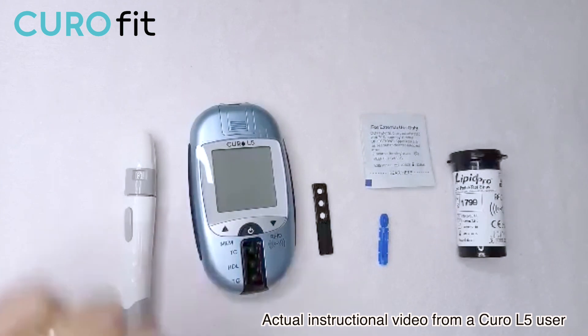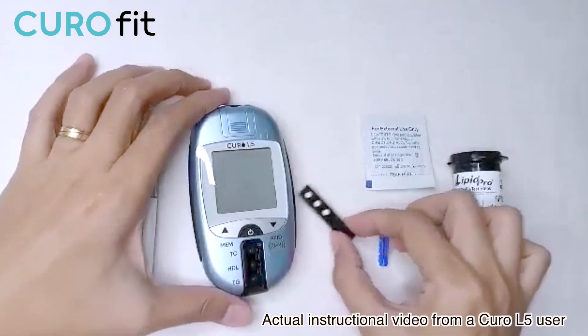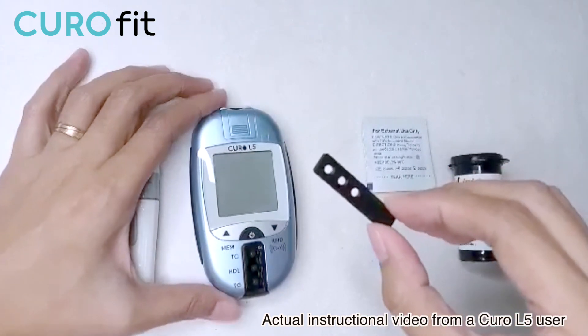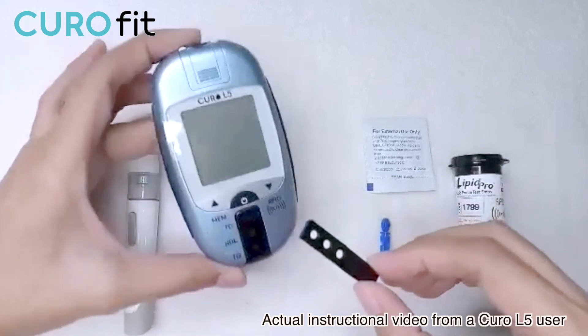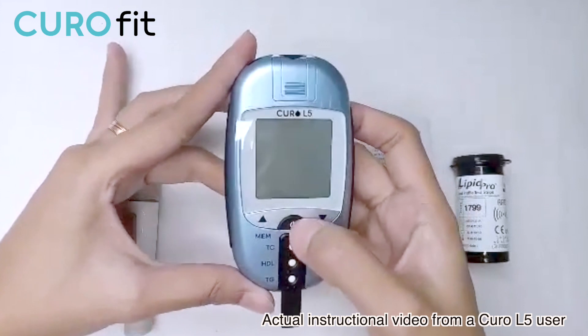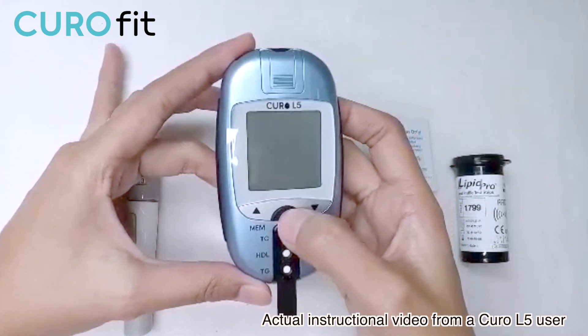Now insert the profile testing strip at the bottom of the device. This profile testing strip is colored black and has three holes. Each hole corresponds to TC, HDL, and TG. Then press the power button.